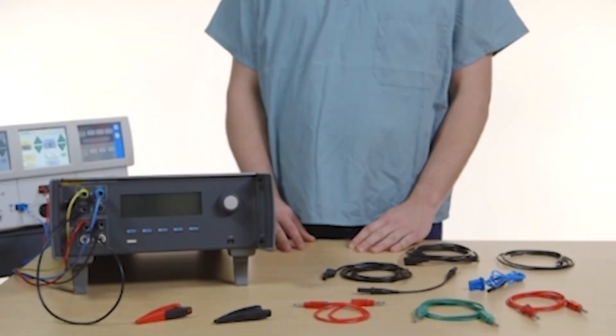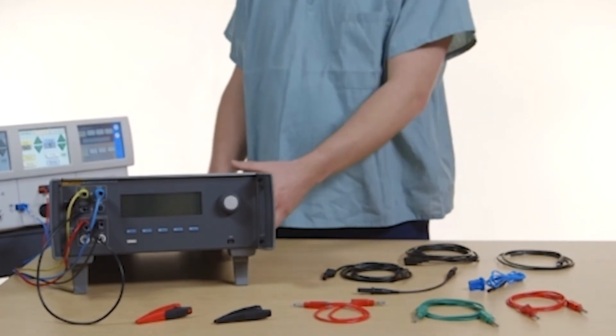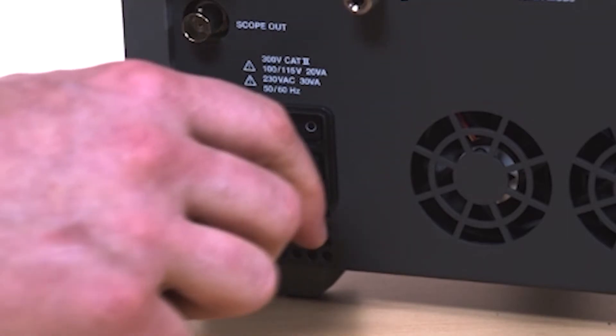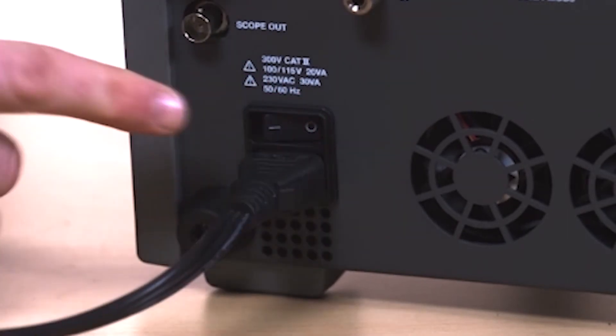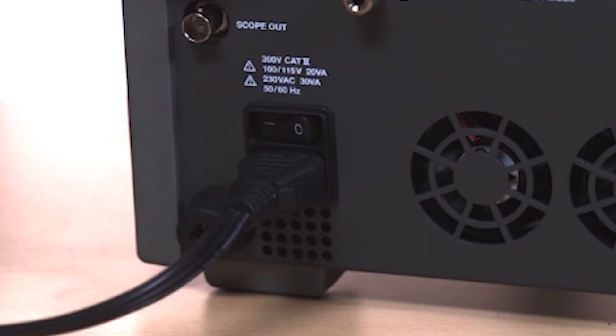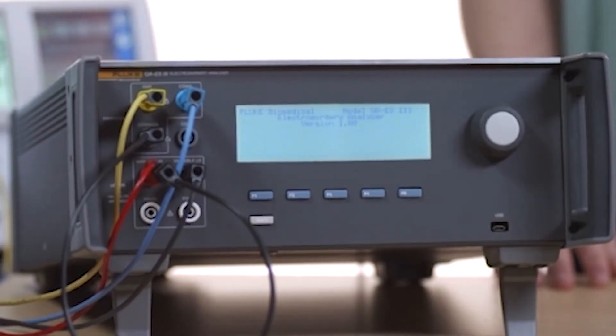Let's run some tests to show how the QAES3 is used to test an electrosurgical unit or ESU. First, connect the power cord to the main power on the back of the QAES3 and turn on the power. The startup sequence will automatically begin.